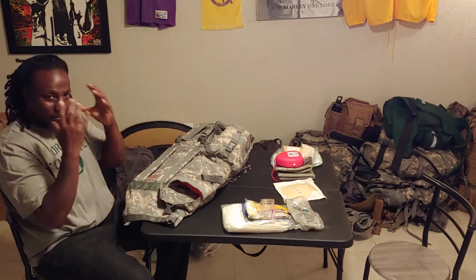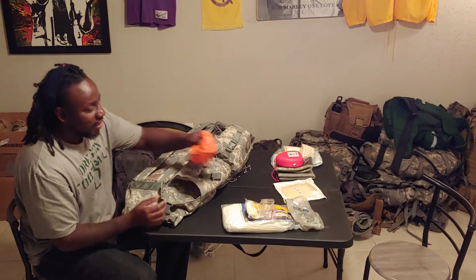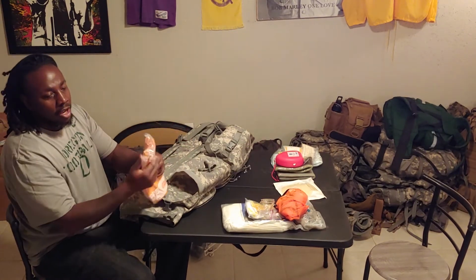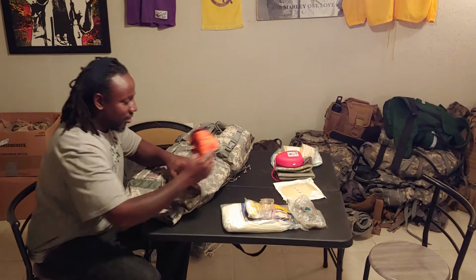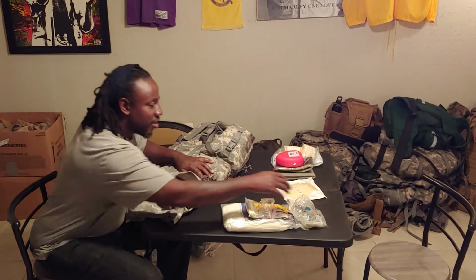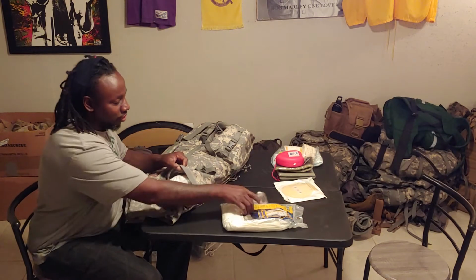But I had them, you know, keep your eyes clean, body clean, safety vest. Maybe it's a roadside emergency. Gotta be safe. And the long gloves. Just your basic pair of long gloves like that. I'll go ahead and put that back in there real quick, at the bottom. Try to put everything in there in an order of use.